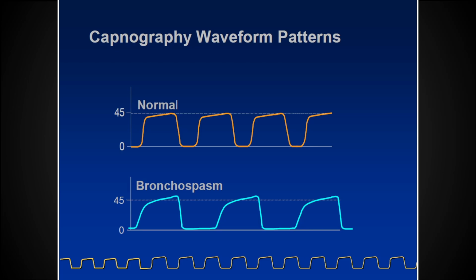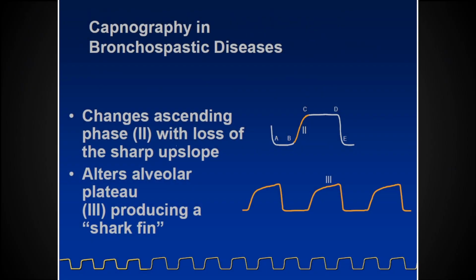It's taking way more effort. So the alveolar plateau is not always slanted, but it is slanted forward in both of these cases. It just has to do with how it's really easy to get CO2 out of your trachea. It's much harder, essentially, to process it from down here, and that changes the speed at which it's expired. But again, the emphasis is on the shift here, the shark fin, right?